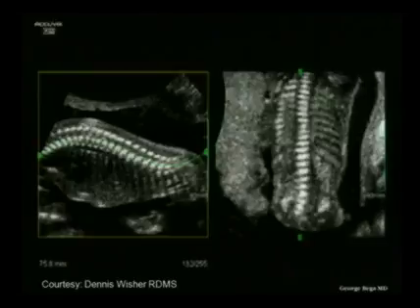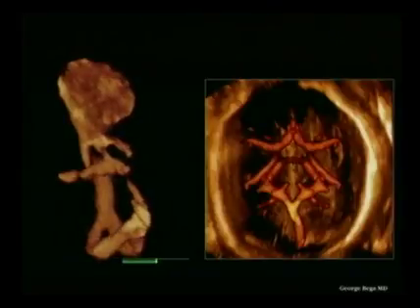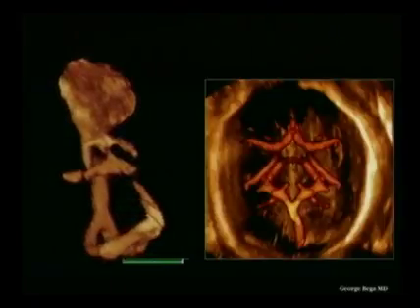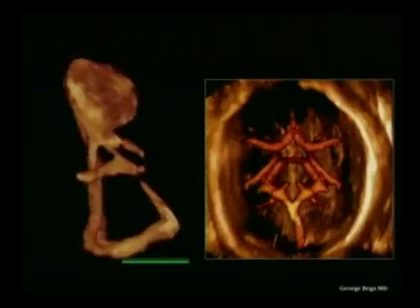So in this particular case, as you can see, the green line represents a rendering line along the curvature of the spine, and here is the corresponding display. Of course, volumes can be obtained with color or power Doppler. These acquisitions are slow. Typically, these are acquisitions that are not in 4D modes, can only be done in a 3D mode, and of course are subject to artifacts.